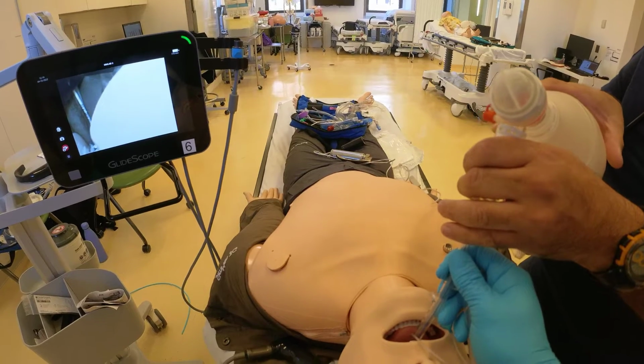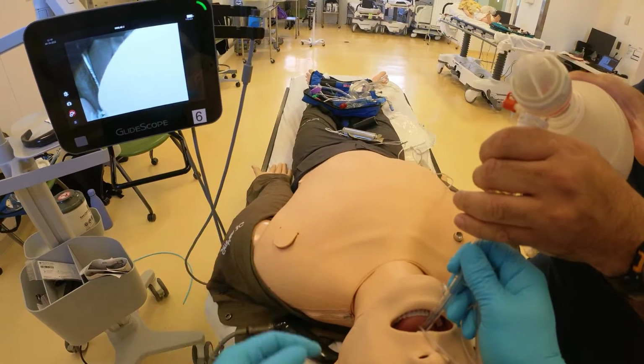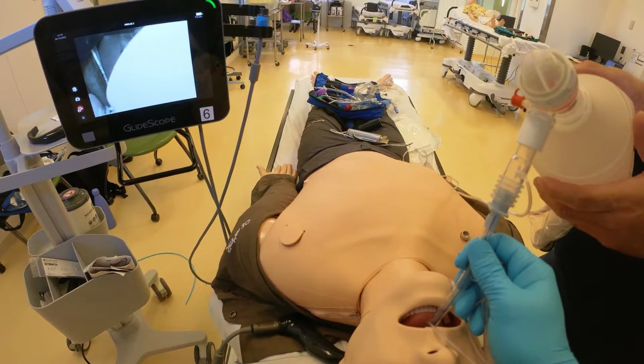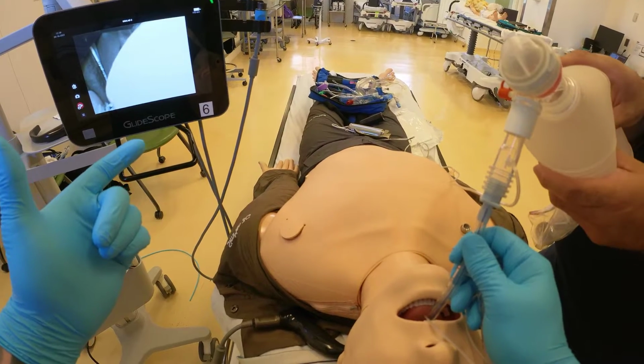Excellent, right? We see chest rise, so we confirm positive lung sounds. We're going to confirm capnography, right? So just to say what's the most important thing, I saw it go through the vocal cords. That's what I'm going to document. So visualization through the vocal cords.